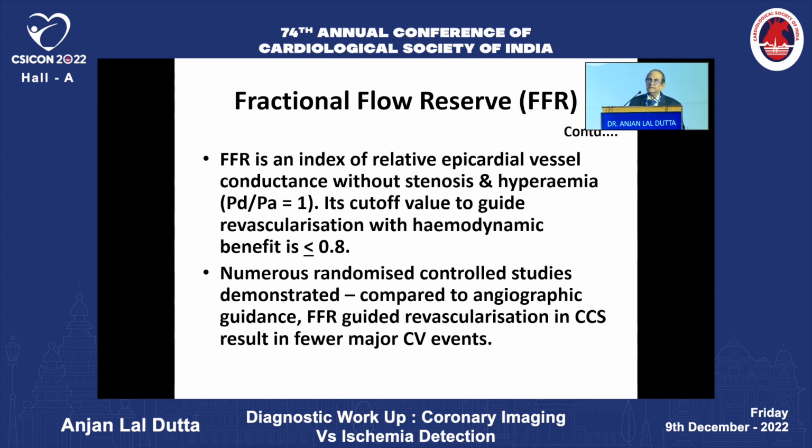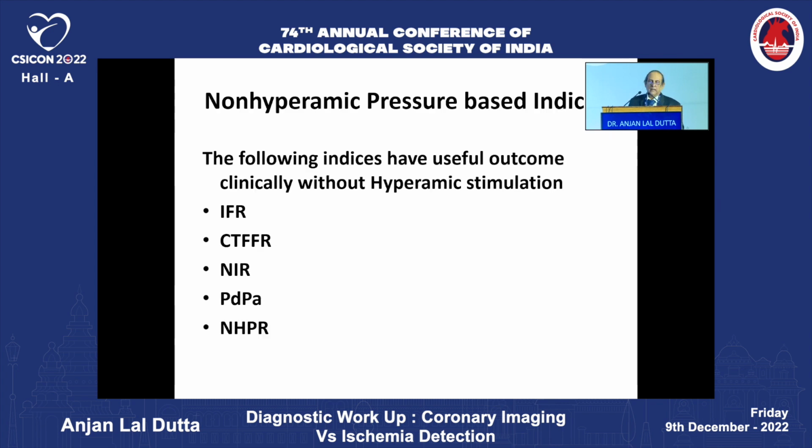So complications are less, outcome is better. Now, when we talk in terms of FFR, we always inject a hyperemic solution before that so that hyperemia is created and the gradient between the proximal and distal part of the lesion becomes more pronounced.